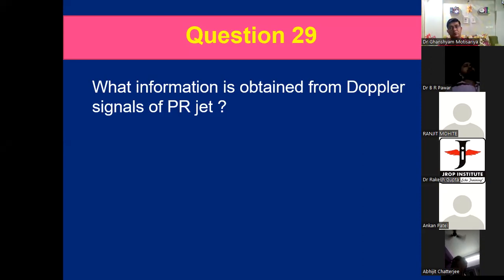So can you measure the pulmonary end diastolic pressure? And how do you do that? Sir, that I don't know. Sir, I think we'll have to ask the next question. Next candidate. He doesn't know. Dr. Nitin? Nitin does not seem to be there.